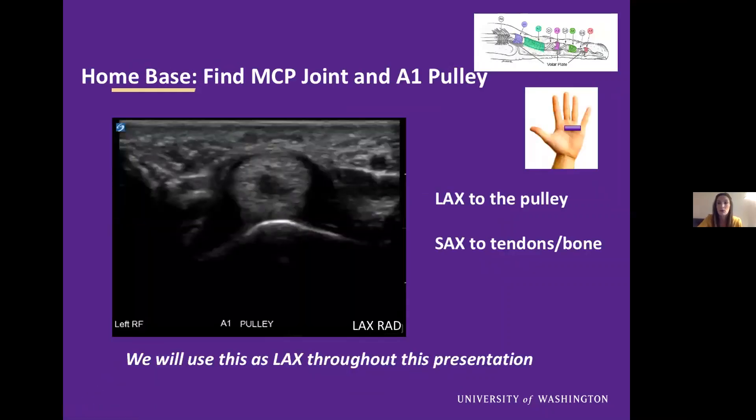Moving on to our ultrasound evaluation. Finding a home base is always very important. We typically use the MCP joint and A1 pulley as our home base — you can always go back to this pulley if you're confused about where you are and watch that come off and watch the new pulley start. This is long axis to the pulley. It can be confusing because typically we're looking at the tendon — so this is short axis to the tendon and bone, but long axis to our pulley, which is our primary interest and target.